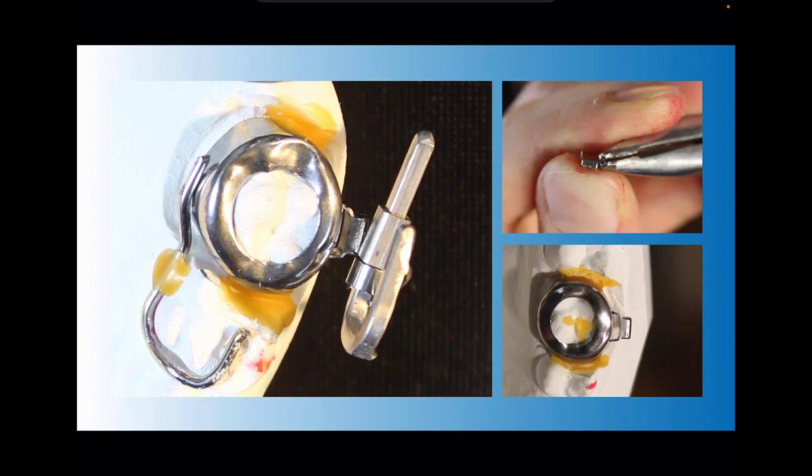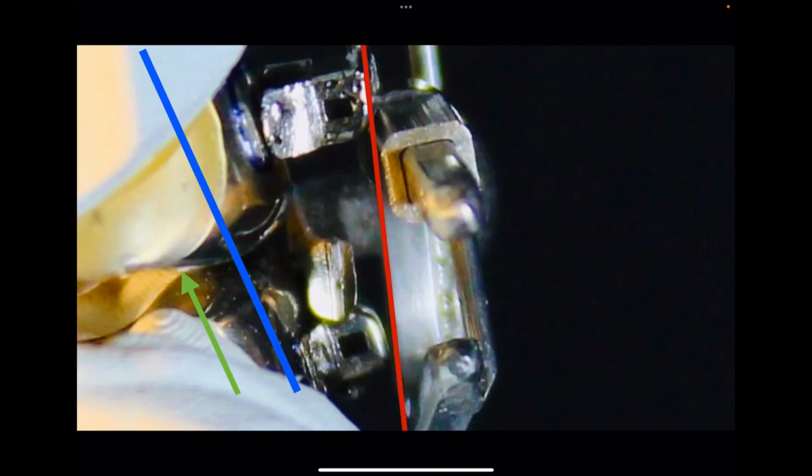Next, here's a photo showing all three things at the same time. You can see that the upper archwire tube is in alignment with everything else, and you can see how we shimmed out that archwire tube in order to create the clearance we need. This is another angle in order to better illustrate how that shimming works out. The red line indicates the clearance from the lower archwire tube.